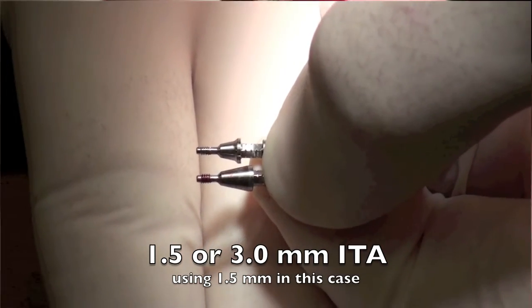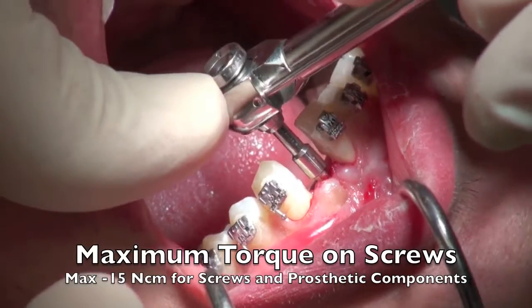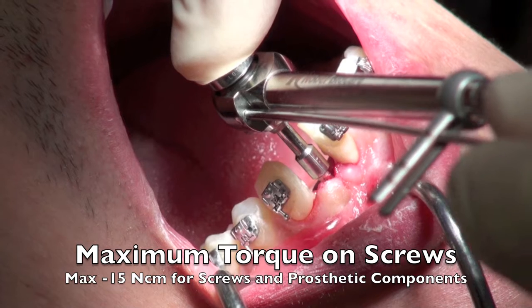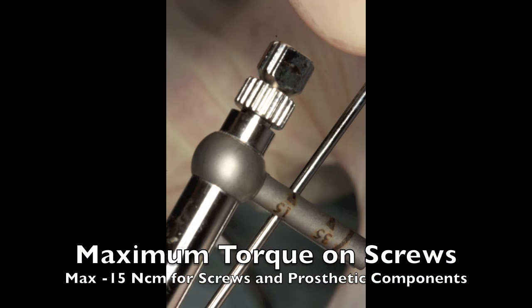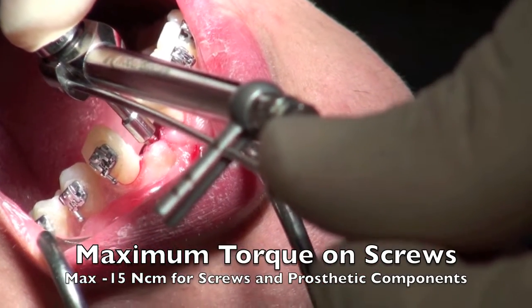The abutment should never be torqued to more than 15 newton centimeters. It comes in two different lengths, so depending on how deep you have to put the implant — in this particular situation we're using a 1.5 millimeter immediate temporary abutment. All prosthetic screws and abutments are only torqued to 15 newton centimeters.